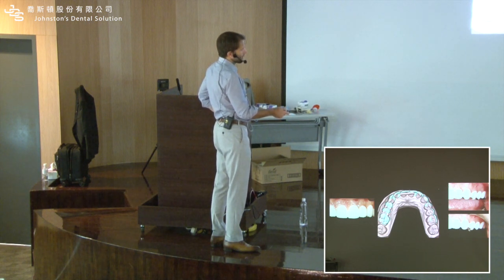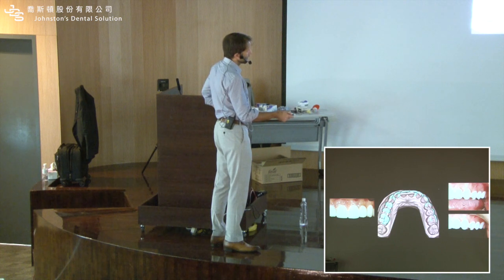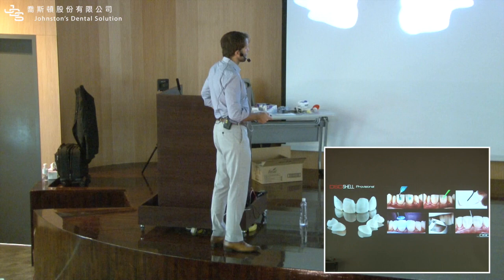So I use a lot of black marker with my mock-ups and also pink composite. Look, pink composite to simulate what? Orthodontics. So here, this case here, I'm selling orthodontics and veneers. So we do a lot of mock-ups to show to the patient the benefits of doing the ortho treatment.